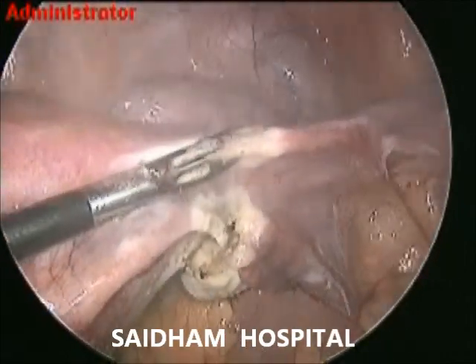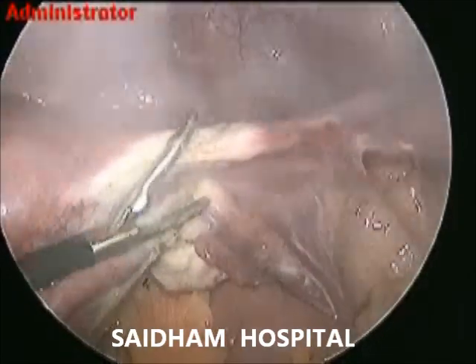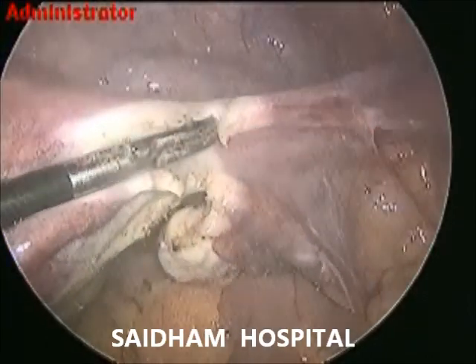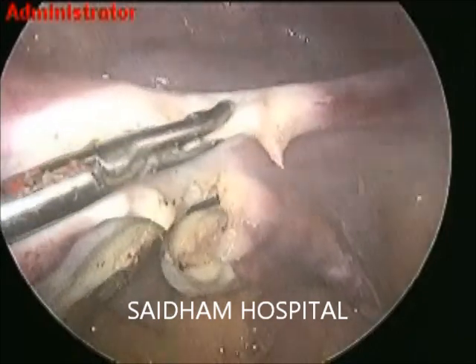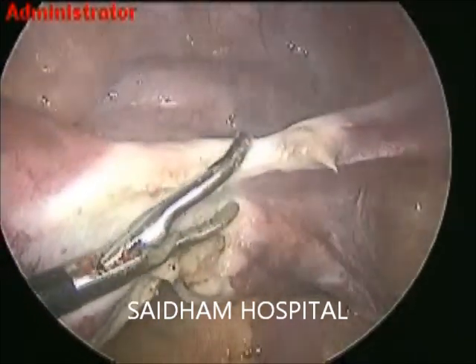We should cut the utero-ovarian ligament just perpendicular to the IP ligament — that should be the rough protocol. Now I am coagulating the round ligament on the right side. The left side cornuals, broad ligament, and right side cornuals are very accessible structures, so we immediately intervene.